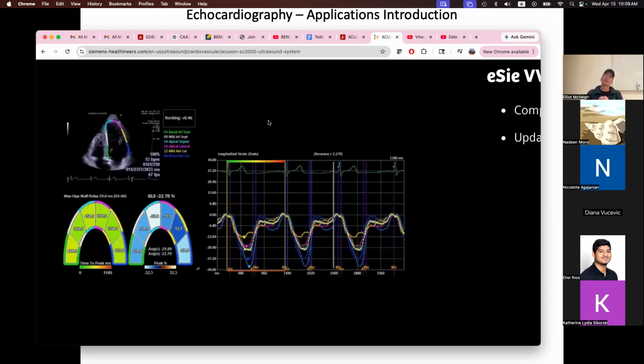It's surprisingly reproducible. Obviously there are certain times when, if you have a really tight stenosis and it's just a jet of flow, then that's all going to be random turbulent flow coming out of the jet. But for the most part, the flow rates and the viscosity and everything about the blood make it exceptionally reproducible from beat to beat. So this is a functional map over time.